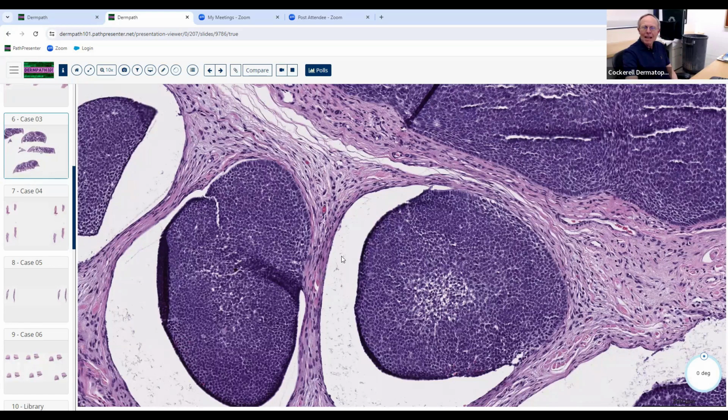So it doesn't have the same adhesion, if you will, to the epithelium that it normally did if it were not a cancer. So here it's still got a little of the adhesion, and here it's kind of lost it. And this is actually something that is present in vivo. If you do confocal microscopy of a basal cell carcinoma, you'll actually see these clefts in the person.